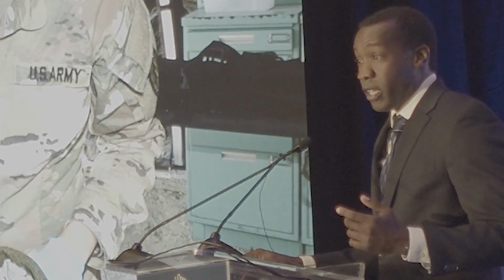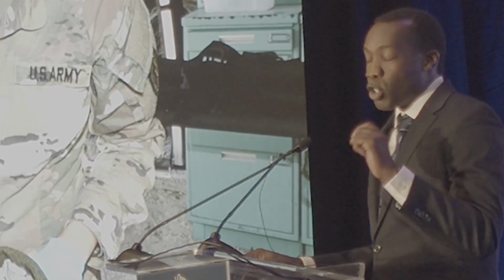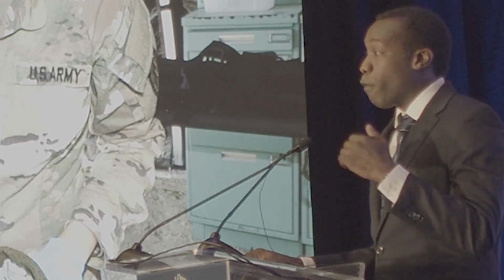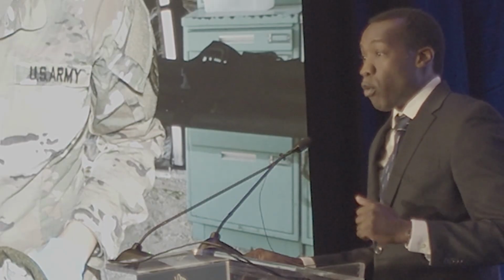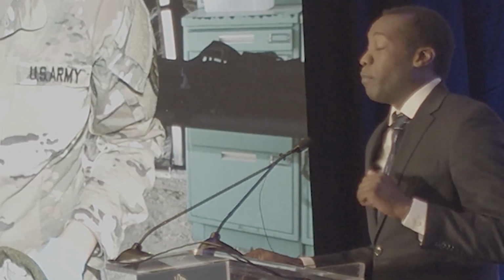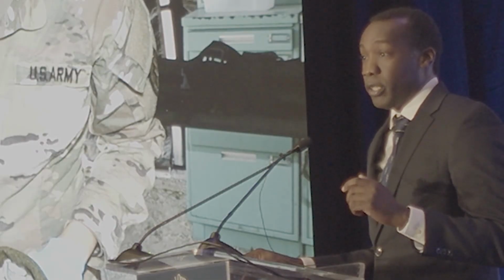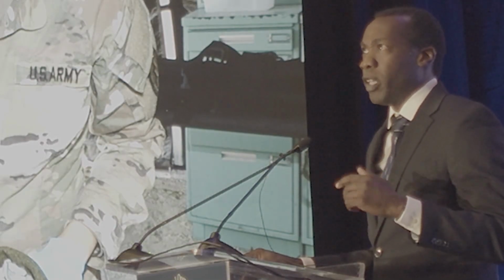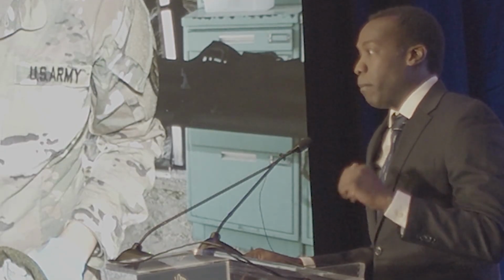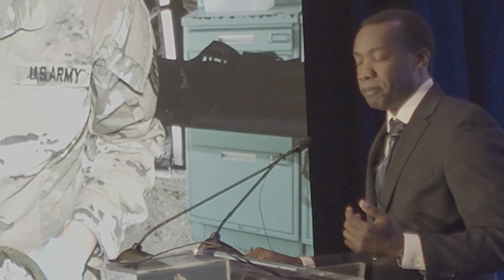Now, to optimize that care, Joint Trauma Systems has called for development of a smaller, lighter, and less energy-intensive medical equipment for forward use. Portable handheld ultrasounds meet these requirements. Handheld portable ultrasounds have been utilized by SAR for over a decade. But recently, the U.S. Army Research and Development Command, or Medical Command, has started to field 3,500 portable handheld ultrasounds for those far forward units. And those are going to be going to our Role 1s and Role 2s.